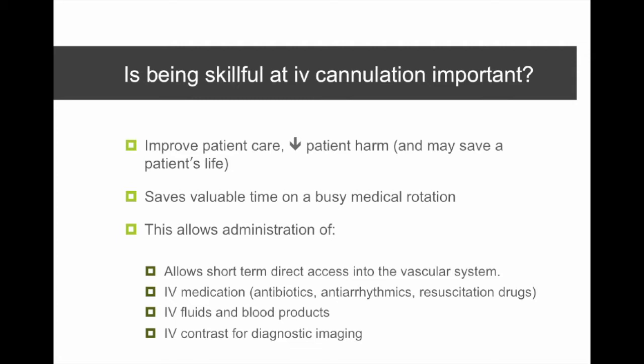It allows short-term access to the vascular system, and so you can give IV medications, antibiotics, antiarrhythmics, resuscitation drugs, and a lot of urgent medications, but also IV fluids and blood products as required, and IV contrast for diagnostic imaging.